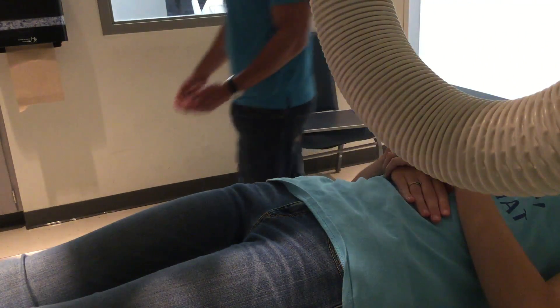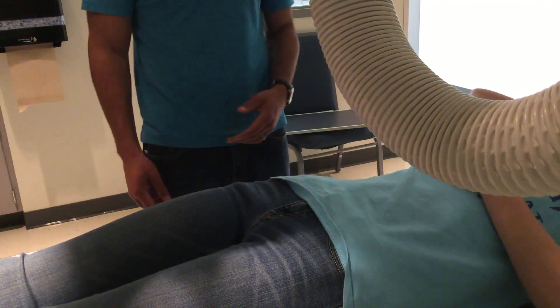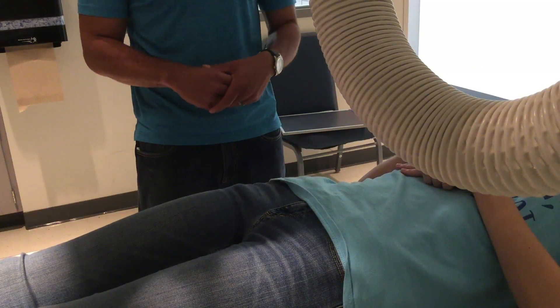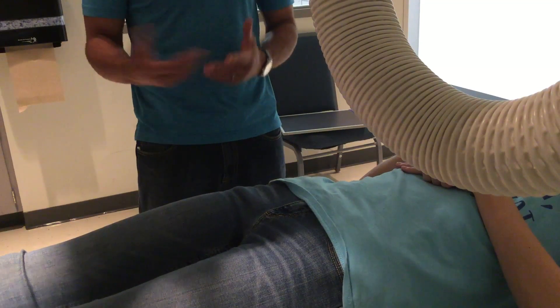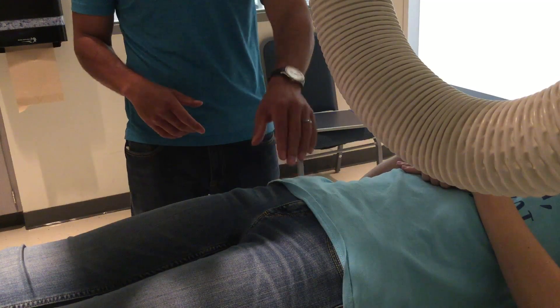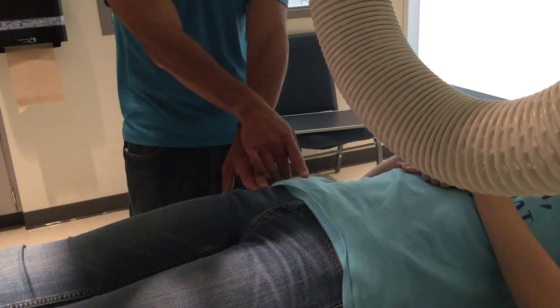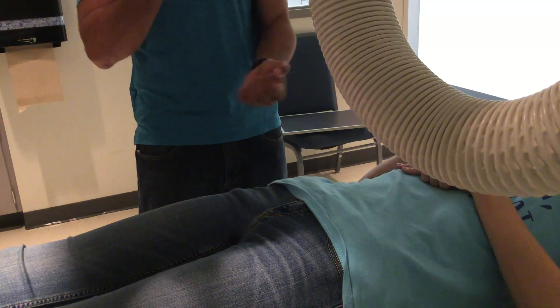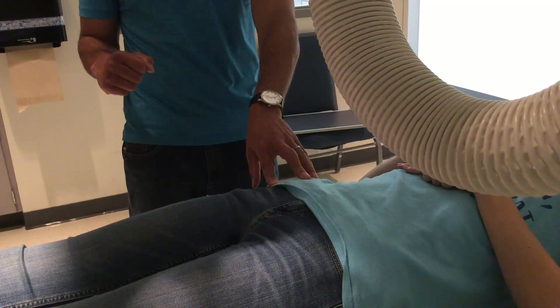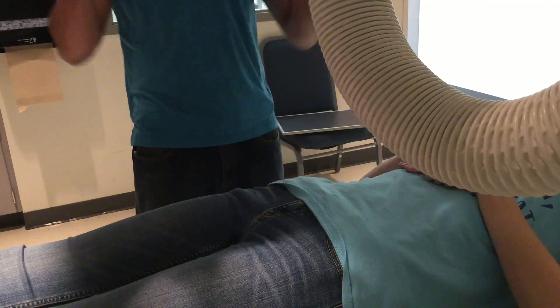We are going to do sacrum and coccyx. It's typically a three-picture series if you're doing both — a sacrum AP axial, coccyx AP axial, and then a lateral of both, typically, with some variation. The AP axial sacrum is shot at 15 degrees cephalic, centered to the mid-sagittal plane two inches below the ASIS. The coccyx is 10 degrees caudal, centered two inches below the ASIS in the mid-sagittal plane.